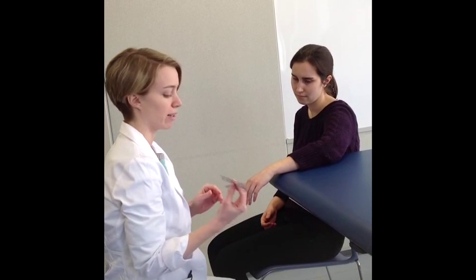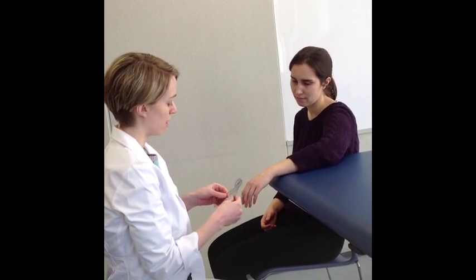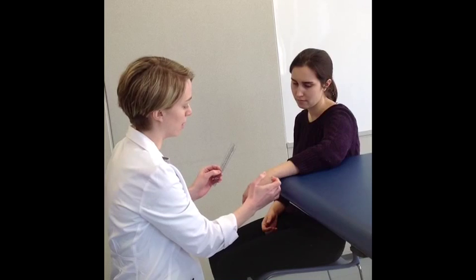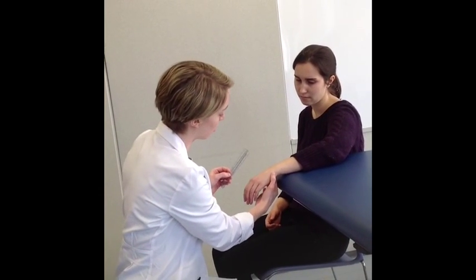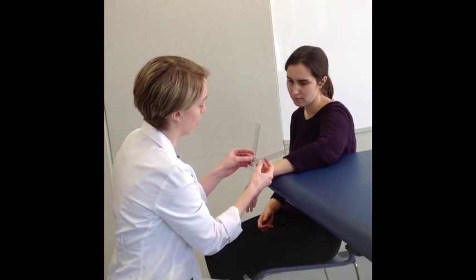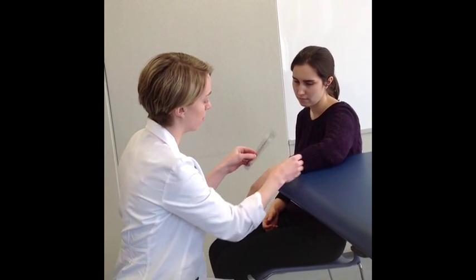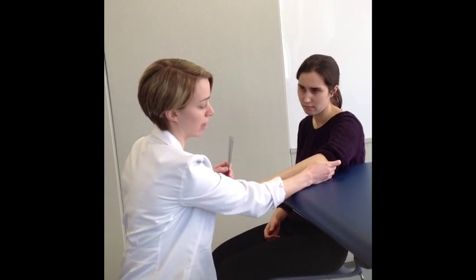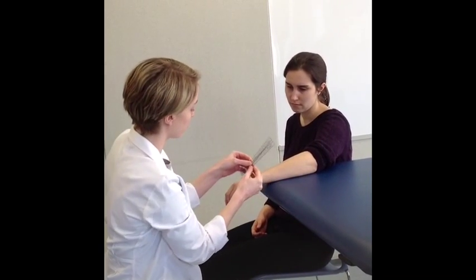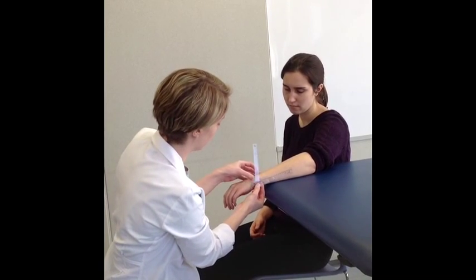As you're aligning the goniometer, the axis is going to be on the triquetrium of the wrist, and you're going to align the stationary arm along the lateral midline of the ulna, and you can use the olecranon process as a guide here. So we're going to line up here.